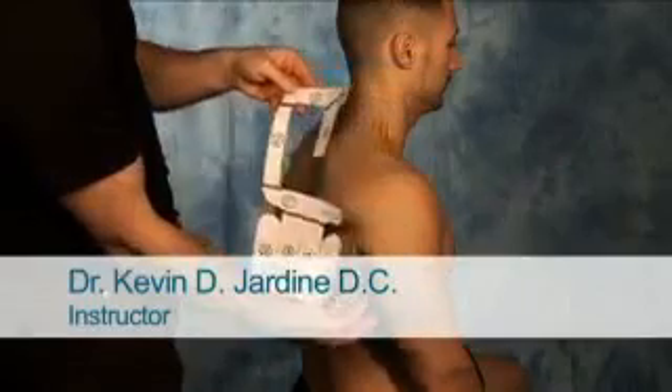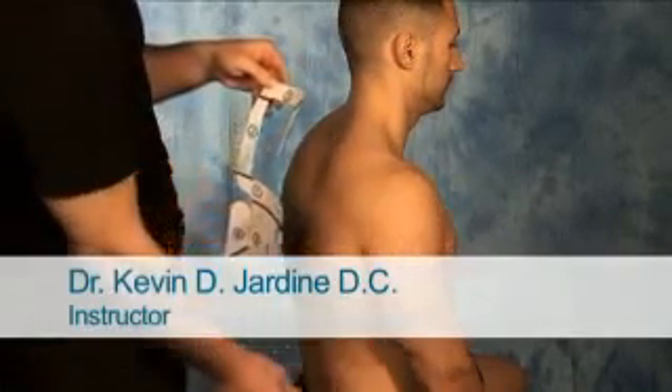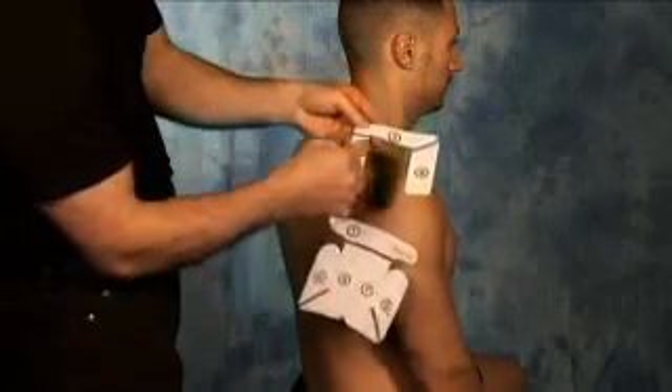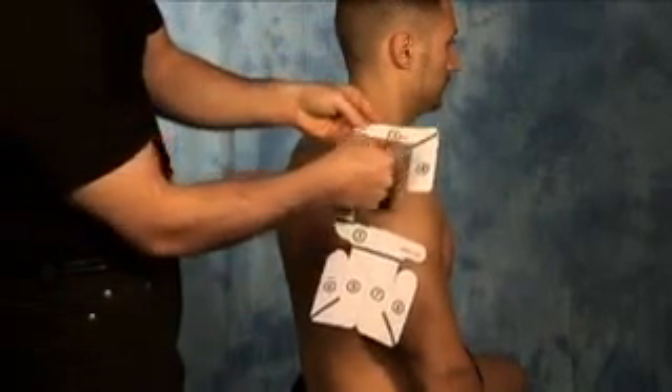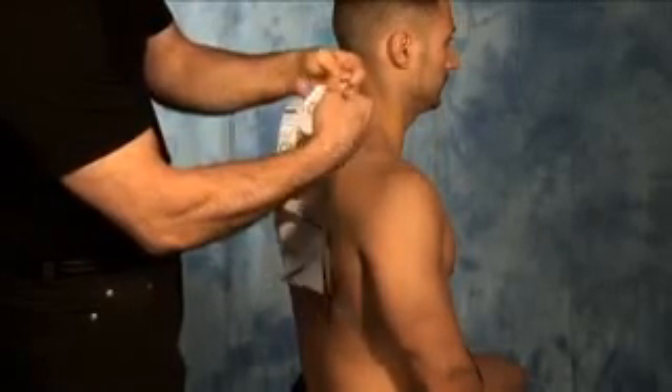Begin by having the client sitting in a comfortable position, the arm just relaxed by their side. Take the application and tear all of the perforations along the black lines before starting the application.